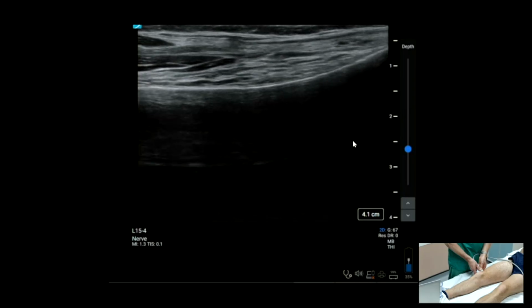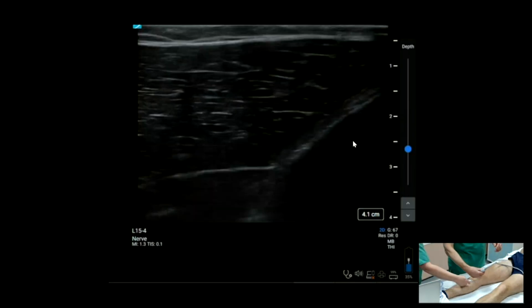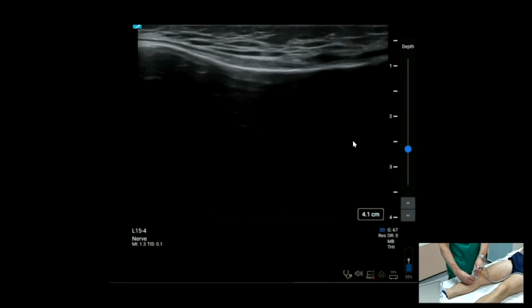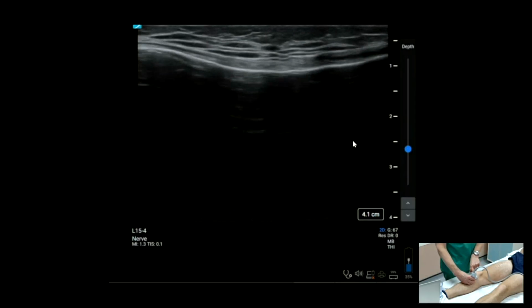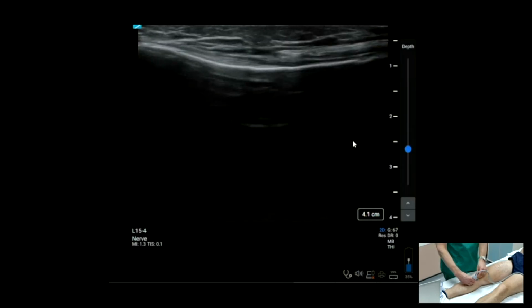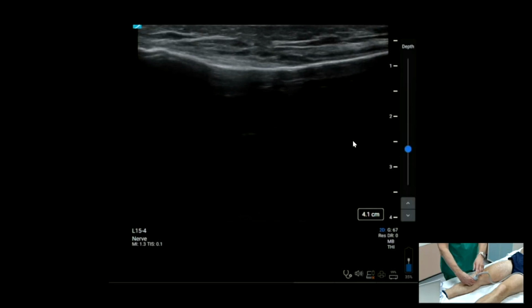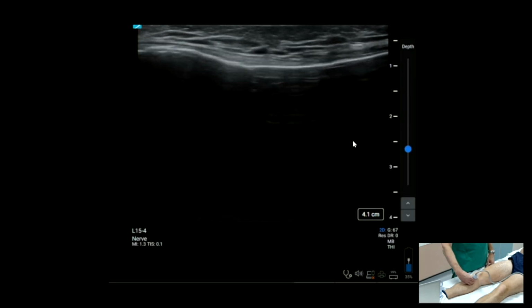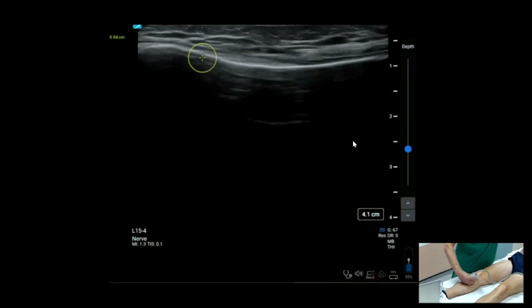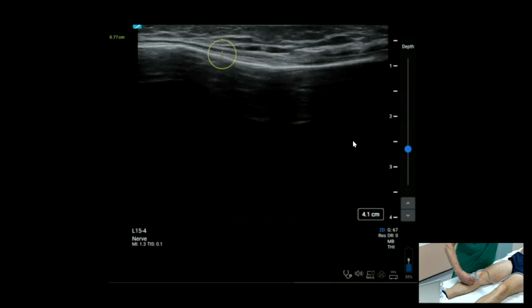So again, bone as an endpoint, really nice, quick, and easy to do. And then just going for the inferomedial genicular nerve, I've come below onto the tibia, so I'm onto the anterior tibia on the medial side, and I've got my probe at a similar sort of 45 degree angle. You can see how again there is a point at which there is a slope up onto the tibia. So the tibia is relatively flat, and then it takes off at this point, and that's our target endpoint about here.